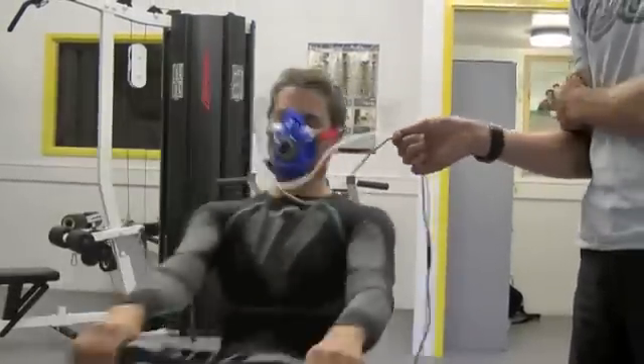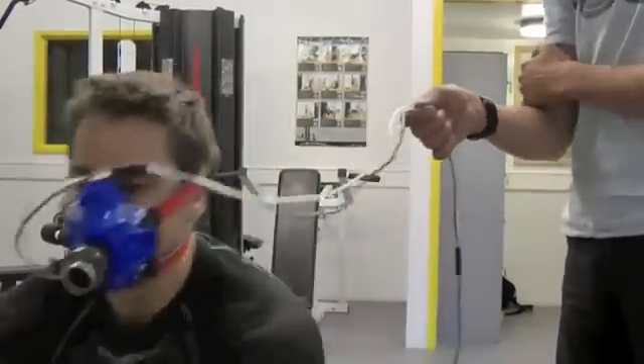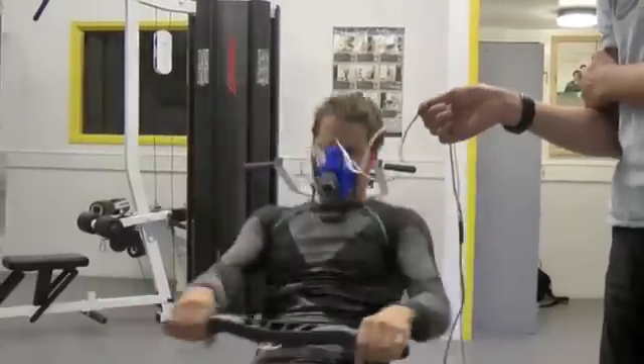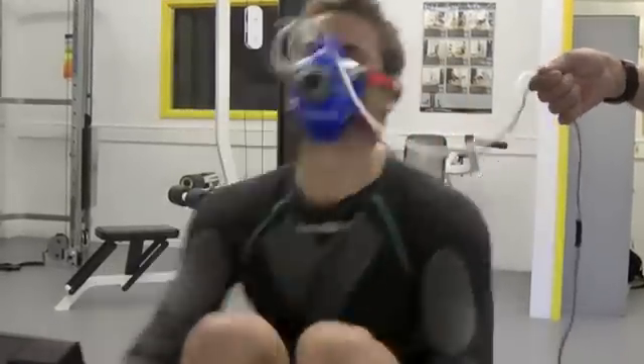Keep it going. Really hard. Keep going Maren. Come on Maren, push it hard, push it harder. Not long to go. Keep going, really hard. Harder! Harder! You've got more in you — I can see it. Keep going Maren. Come on now. This is it. Okay mate, do another 10 seconds on the 30.